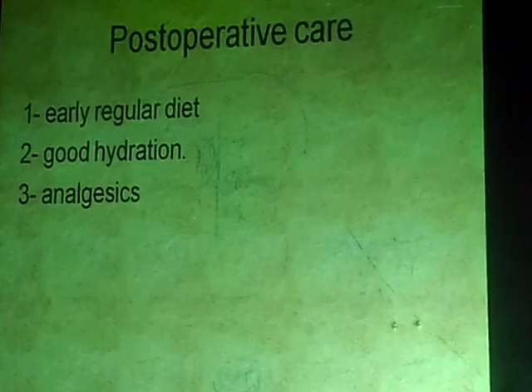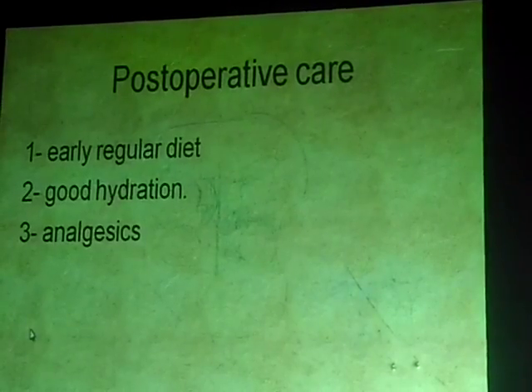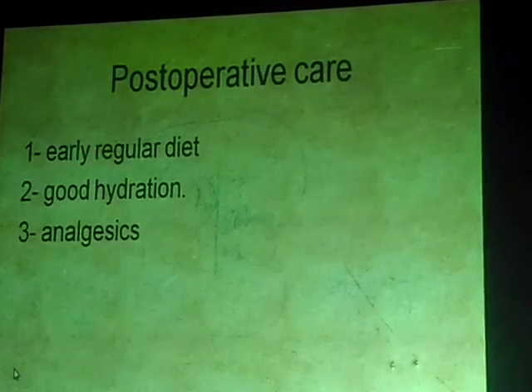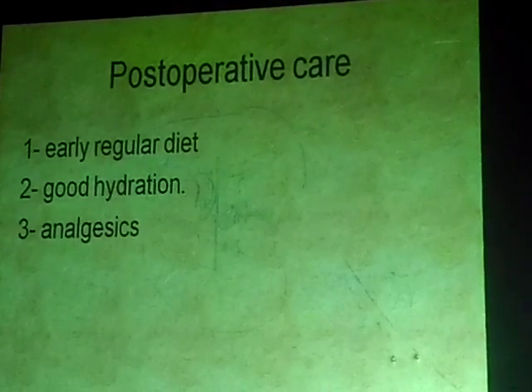Adenoidectomy is one of the most common procedures that we do, and I think by doing it in this technique, this is the way I do it, I think we can have a safe surgery. Thank you.